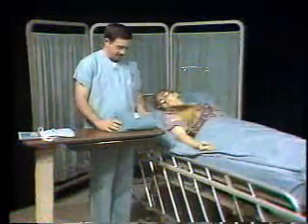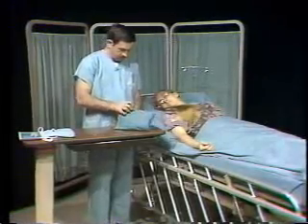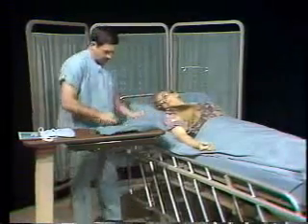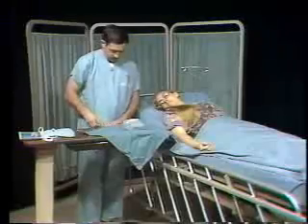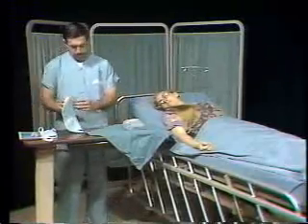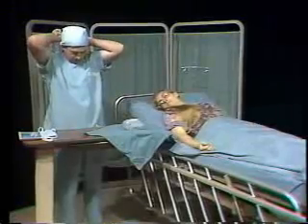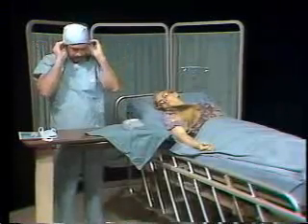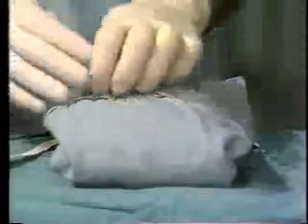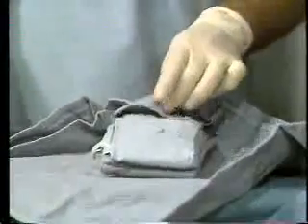Before opening the outer wrapping of the suture set, check the sterilization strip and expiration date on the outside of the suture pack. Also check the sterilization strip inside the outer wrapper. Don the surgical cap, mask, and sterile gloves for the procedure. A sterile gown may also be worn. Then open the inner pack while maintaining a sterile field. Inspect the contents of the pack.